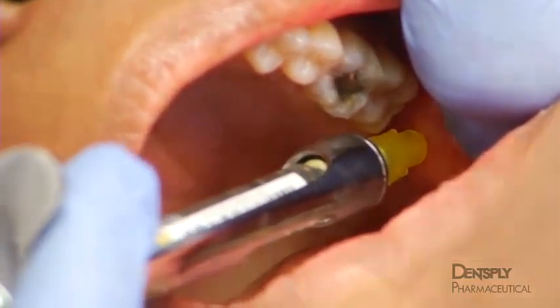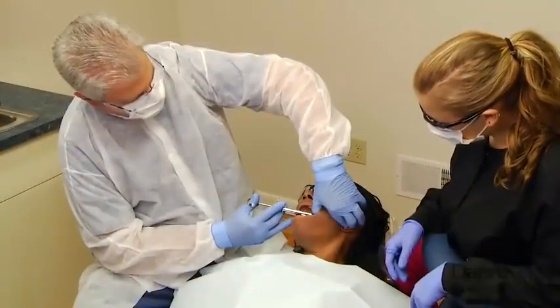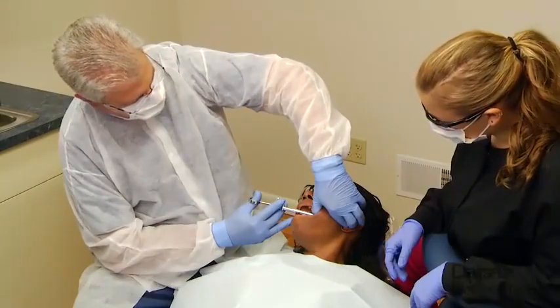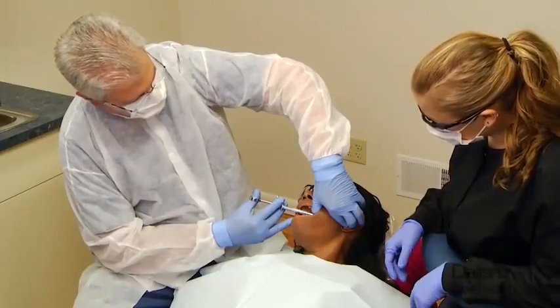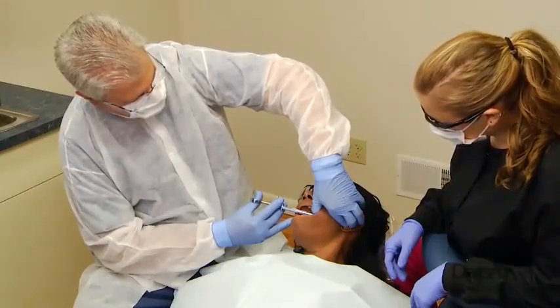is contacted. When the needle impinges on the condylar neck, it is felt as a solid stop, in contrast to a glancing contact. Once the target is reached, the needle is backed off the condylar neck 1 or 2 millimeters, aspiration is performed, and the entire content of the cartridge is injected over a 1-minute period.